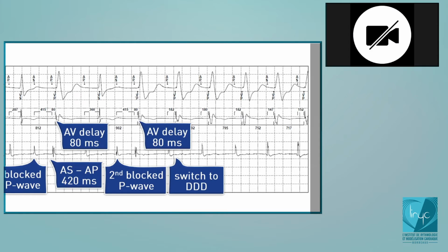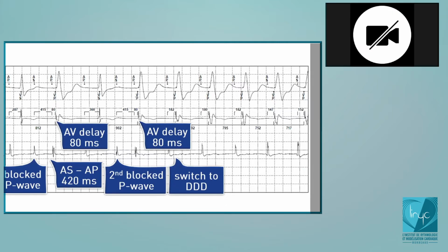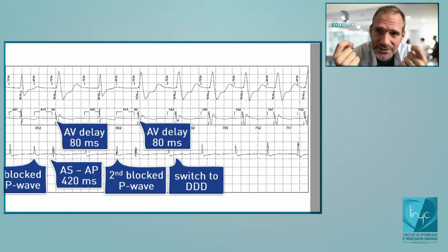Does the PR interval adapt upon exertion? Yes, it does. If you consider the first version of MVP, there was nothing done about the PR interval. Now, the PR interval is monitored on every beat and averaged.